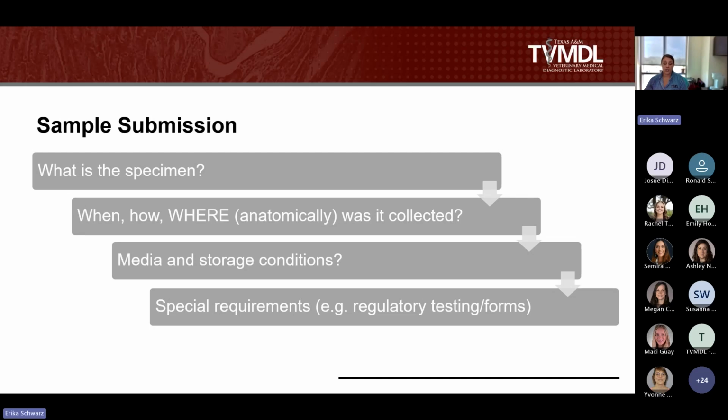I'd encourage you to have a plan before you go out to collect your samples. Check our lab website and the submission guide for any special collection or shipping instructions. And if at any time you aren't sure if something's going to work for a culture, please reach out to us at the lab for guidance. We're always willing to help you through the planning steps, and we can help you to make sure that we can utilize the sample when it arrives.